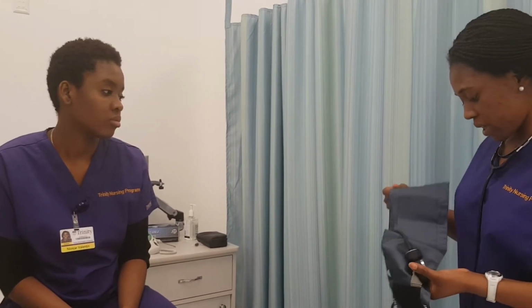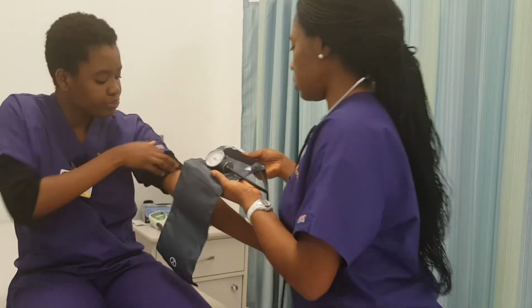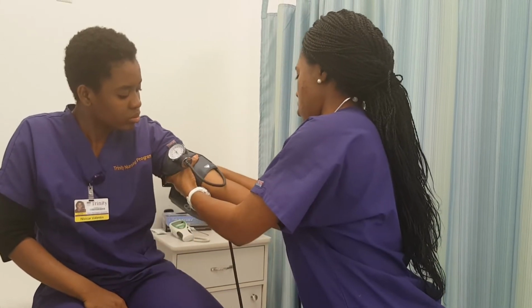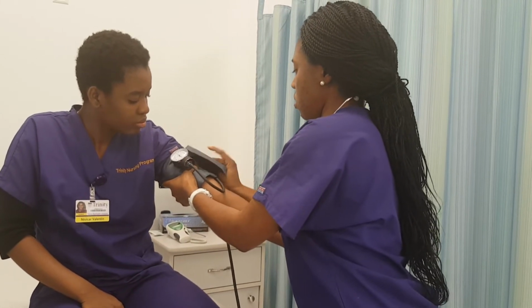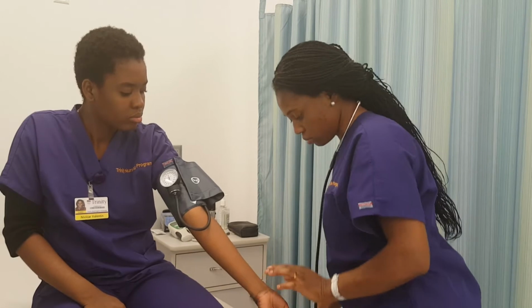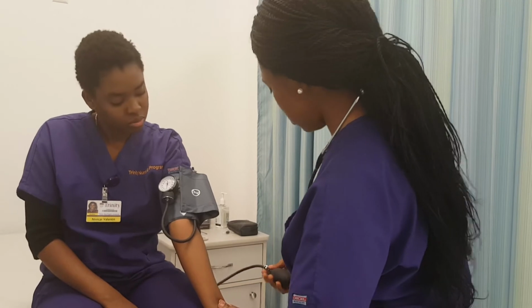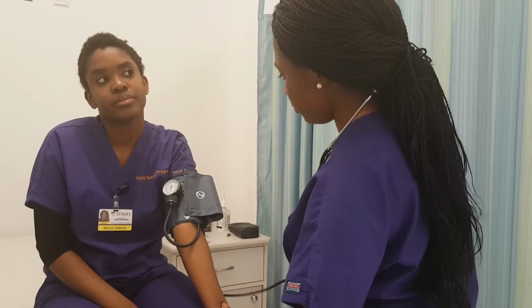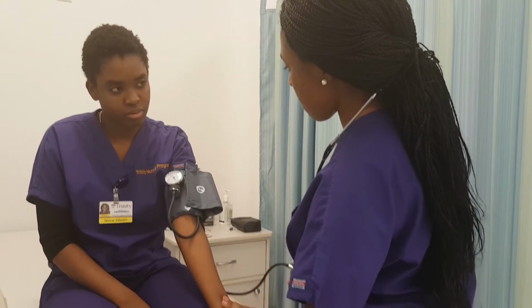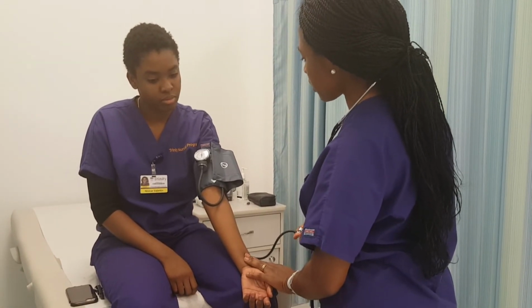So now I'll take your blood pressure. Okay. Can I please have your hand, please? Sure. So I'll stop at 160.